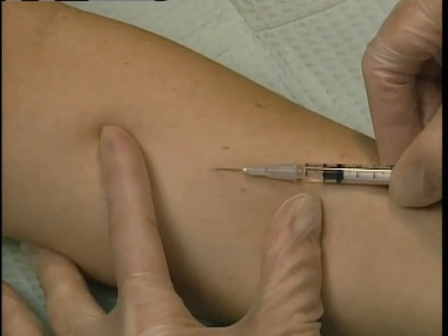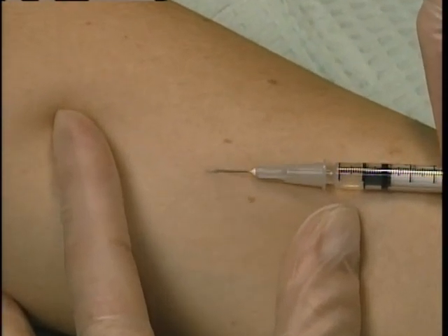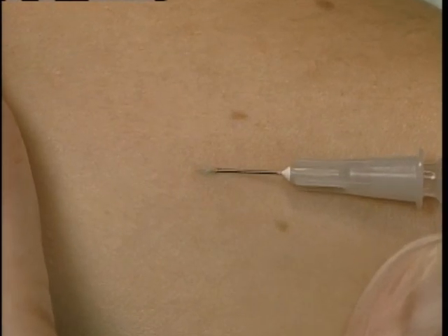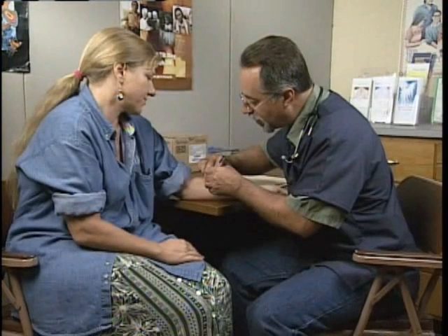In this video, you'll learn how to test for TB infection by administering and reading the Mantoux tuberculin skin test. The Mantoux tuberculin skin test should always be placed and read by a designated trained healthcare worker.